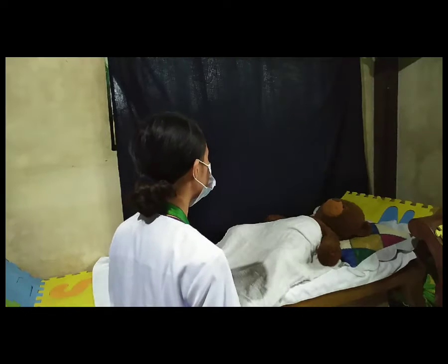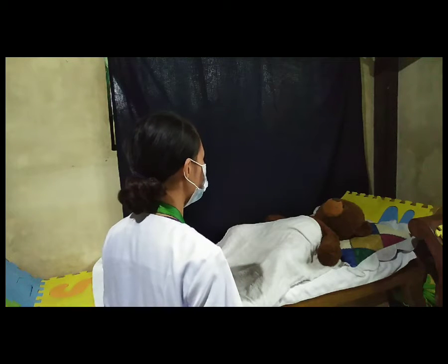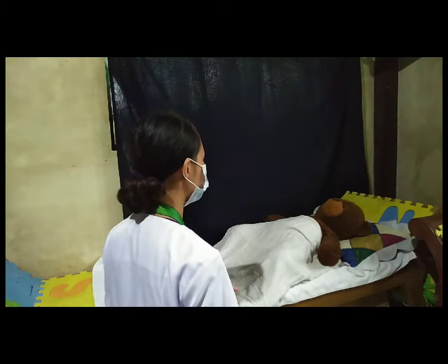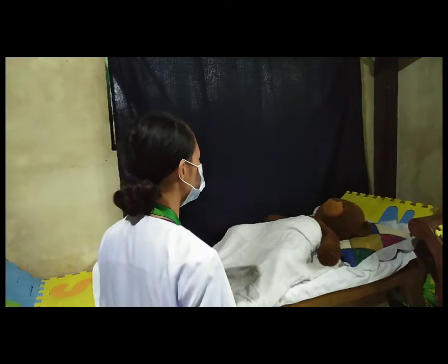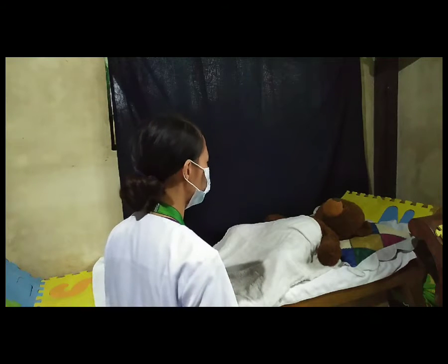Then of course, the most important thing, we should always provide for patients' privacy and get their consent for us to perform the procedure. Good morning, Mom. I'm Christeta, your student nurse for today, and I will be performing your catheterization to empty your bladder of urine. Is that okay with you, Mom? Alright, Mom, thank you.